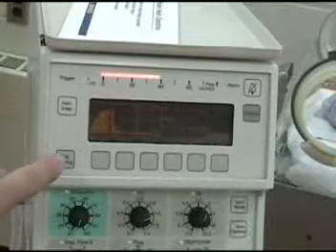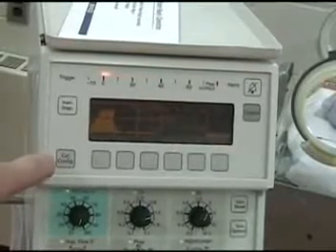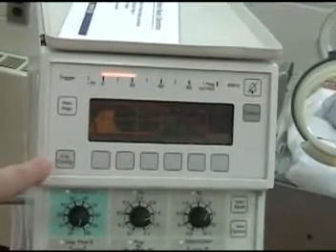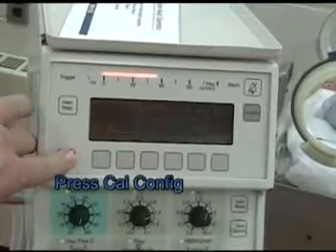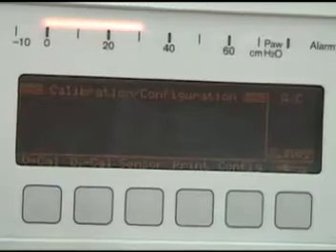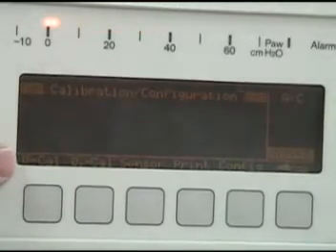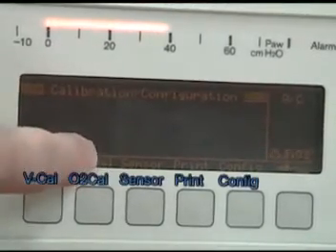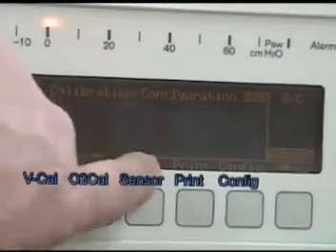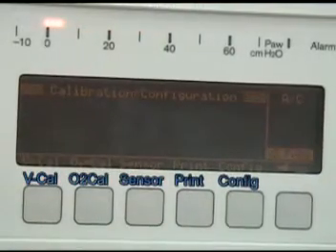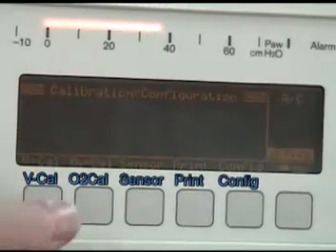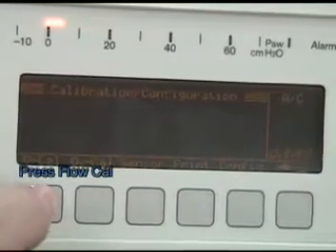Let's take a look at this calibration configure button, and when we press that, you can see that we're going to get some actions that we can do: flow calibration, O2 calibration, sensor calibration, print and configure. So let's take a look at the flow calibration.